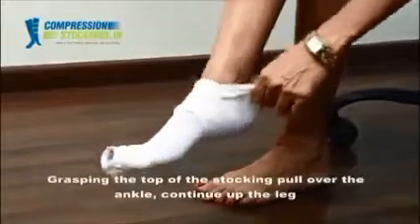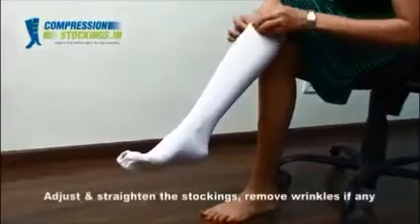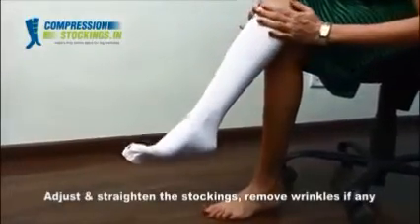Grasp the top of the stocking, pull over the ankle and continue up the leg. Adjust and straighten the stocking as you go up. Smoothen the stockings and remove any wrinkles.